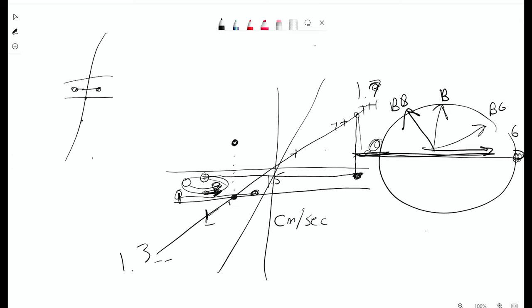Now, if you have a stenotic valve or anything like that, all bets are off. Because it's like putting your thumb over a water hose. Your Venc could easily be 500 centimeters per second. And so everything's going to alias at that point.